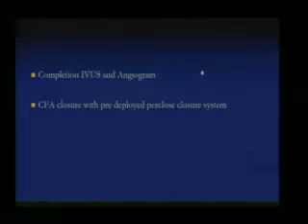After deployment, the common femoral artery was closed with the already pre-deployed Perclose closure system with good hemostasis. The incision size was less than 1 centimeter in this case, and procedure time was around 55 minutes. I think that is important for the audience to know. You have done everything percutaneous. Yes. And you have fixed the artery with the Perclose. Yes.